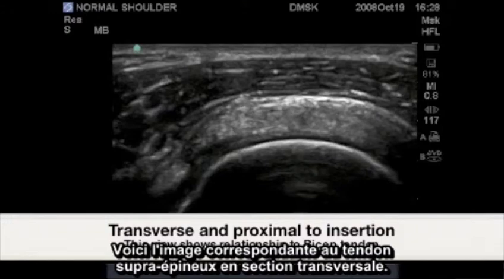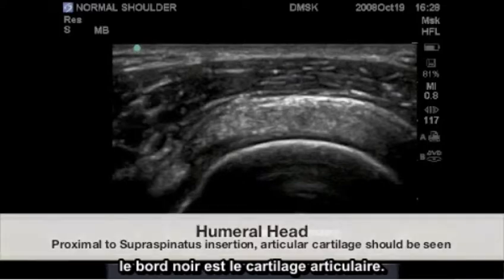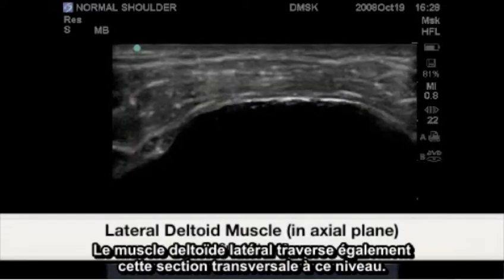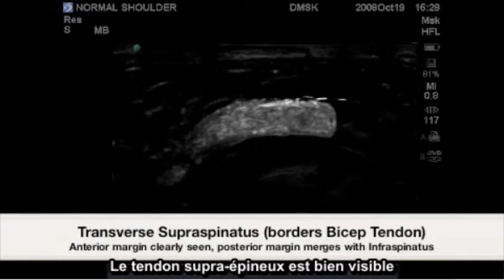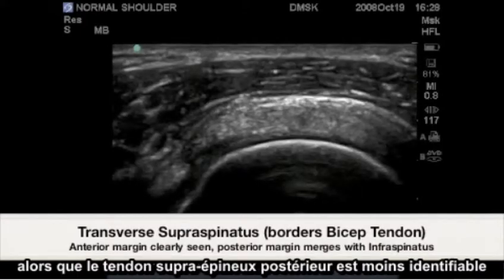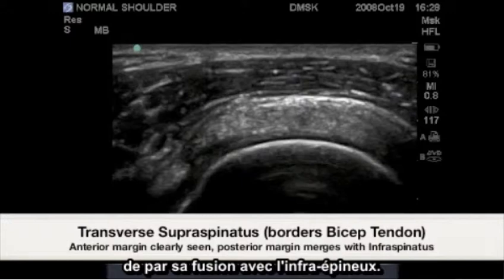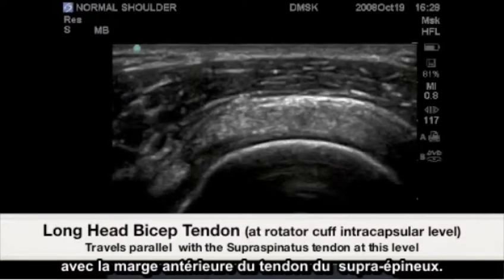This is the corresponding image of the supraspinatus tendon in cross-section. Highlighted here is the humeral head proximal to the supraspinatus insertion. The black rim is the articular cartilage. The lateral deltoid muscle will run in cross-section as well at this level. The anterior supraspinatus tendon is well visualized, while the posterior supraspinatus tendon is less identifiable due to its merger with the infraspinatus. Highlighted in this image is the bicep tendon also in cross-section with the supraspinatus tendon's anterior margin.